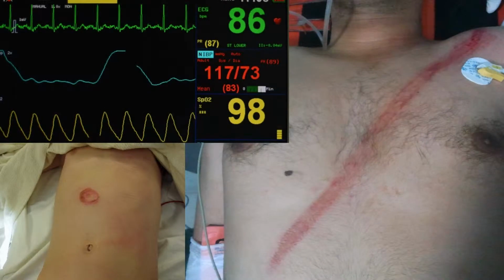For me, stability is the combination of normal hemodynamics and end organ perfusion, combined with a patient who does not require an immediate resuscitative intervention. Unfortunately, even in these patients with patterned bruising and a high index of suspicion for injury, the value of the FAST scan is often brought into question.